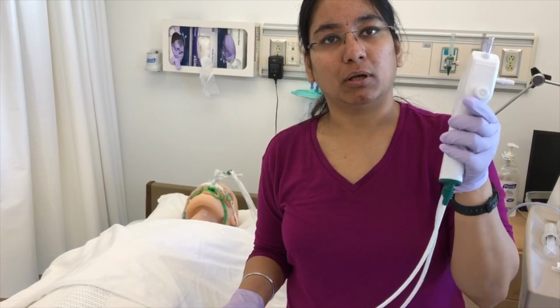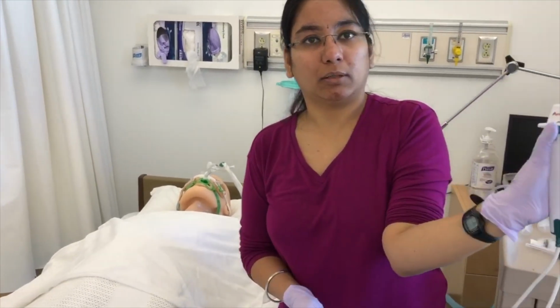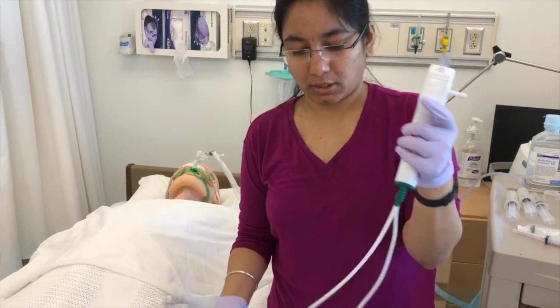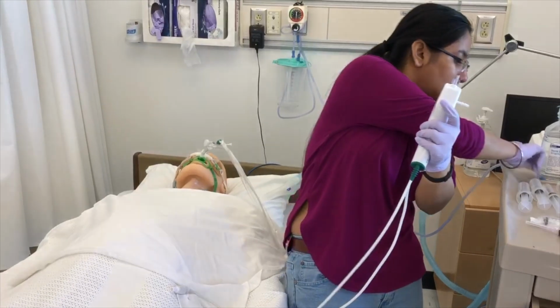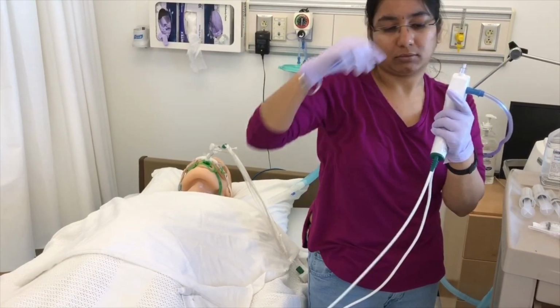So the physician holds the scope in his non-dominant hand with the thumb on the toggle and the index finger on the suction pressure, and the suction tubing is connected this way.